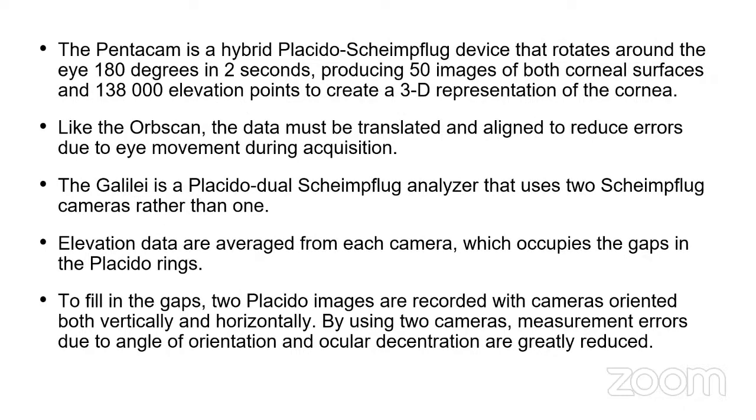The example of the Scheimpflug technique is a Pentacam. The Pentacam is a hybrid Placido Scheimpflug device that rotates around the eye 180 degrees in 2 seconds, producing 50 images of both the corneal surfaces, that is the anterior as well as posterior, and forming 138,000 elevation points to create a three-dimensional representation of the cornea.